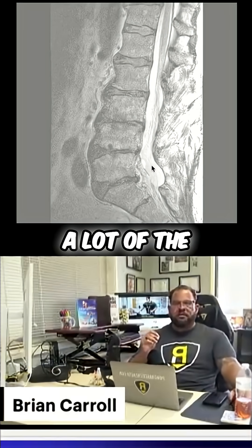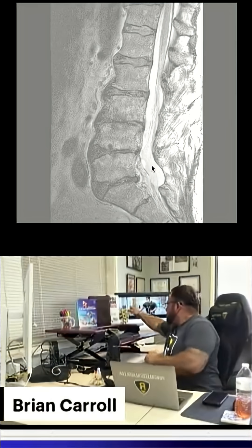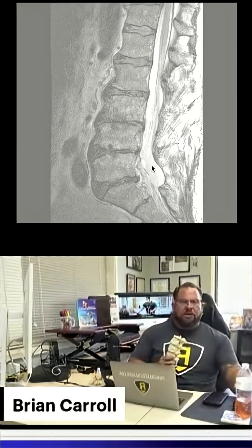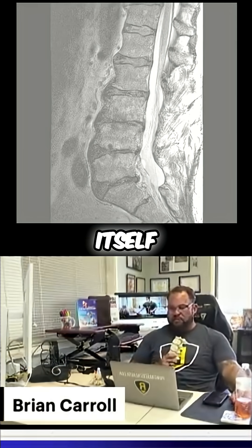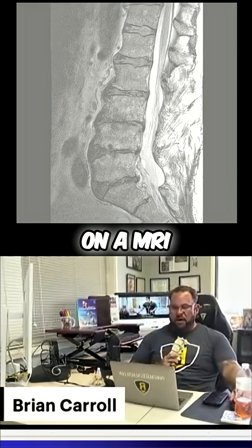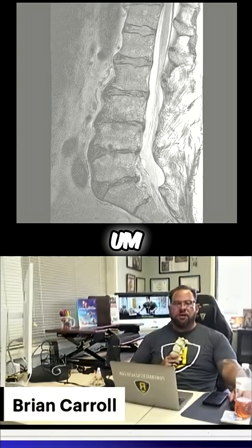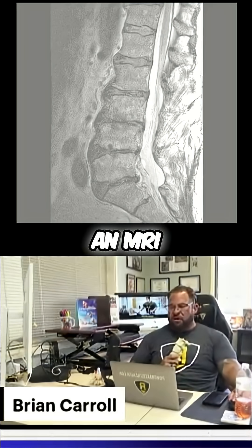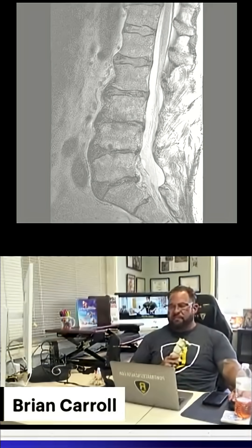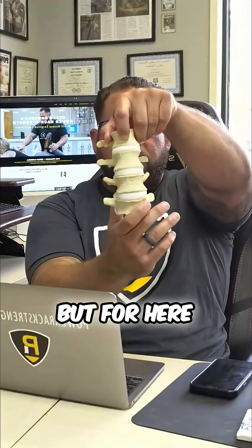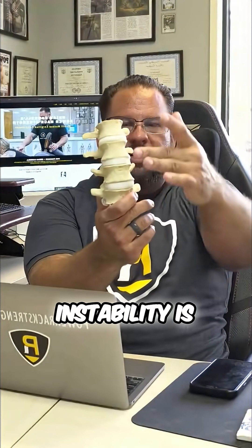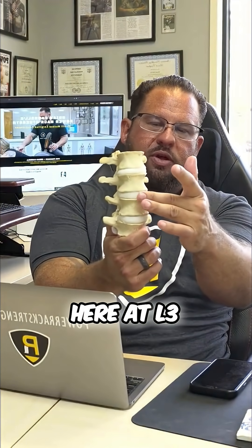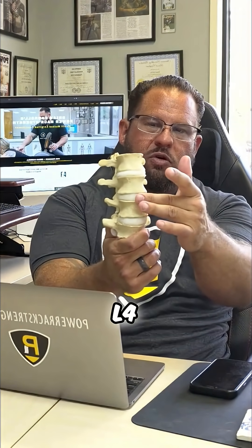A lot of the time we see instability. Instability can manifest itself on an MRI — you can see it sometimes. And here, instability is going to take place right here at L3, L4.